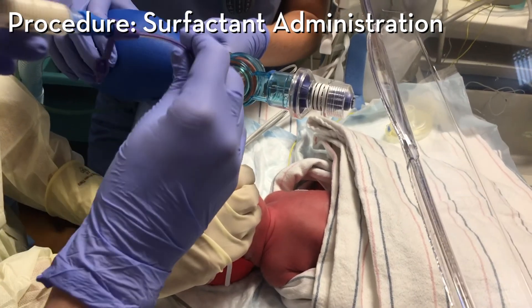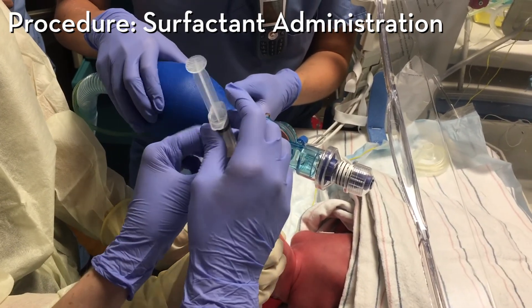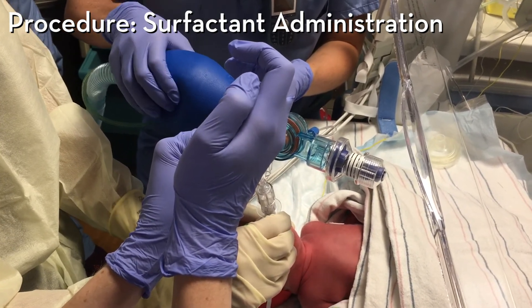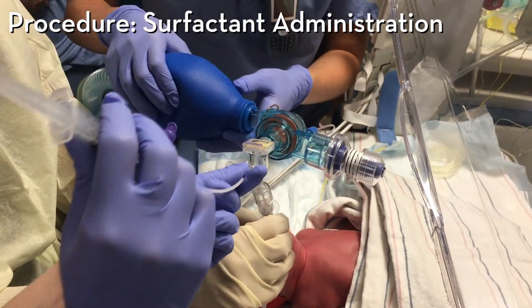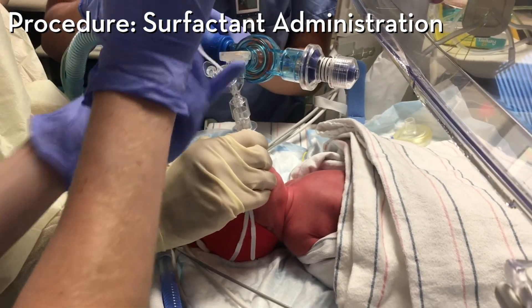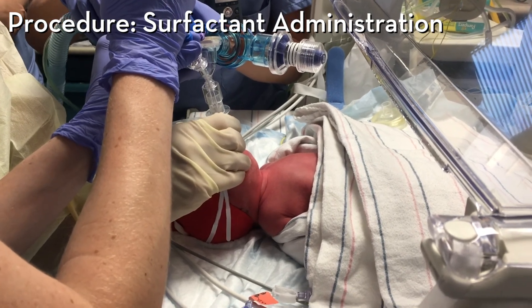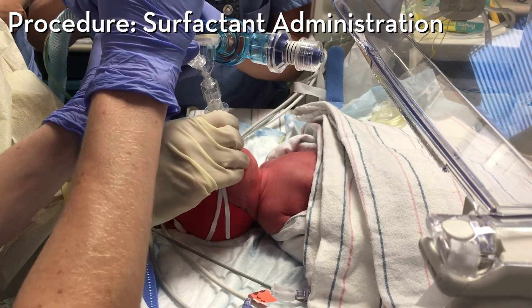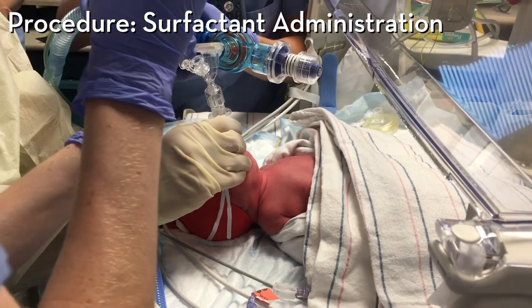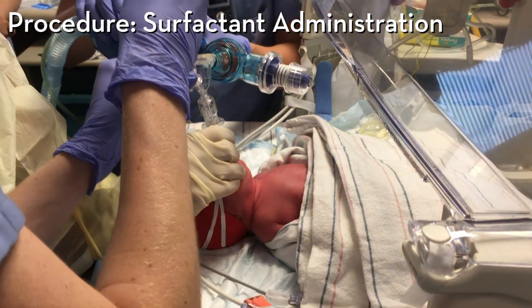Heart rate is 130, saturations are 95. Administering a 2 mL aliquot. Saturations are 100, heart rate is great. Keep bagging all the way through. That's 2 mLs — she's still doing well, 130 heart rate. Last aliquot administered. Then we're done.